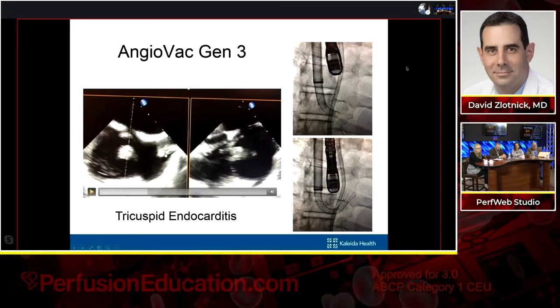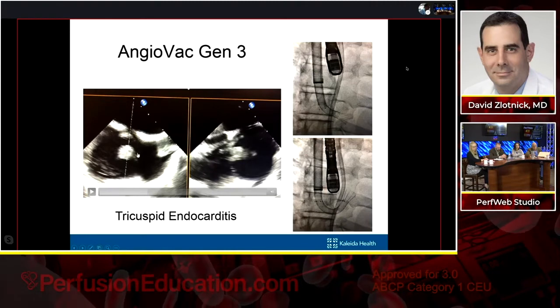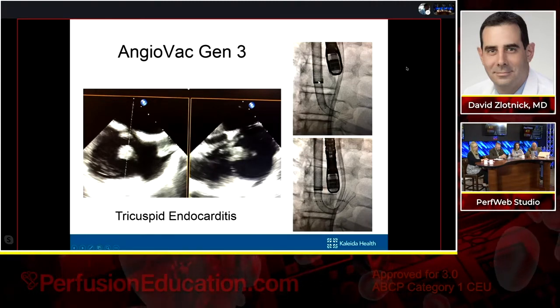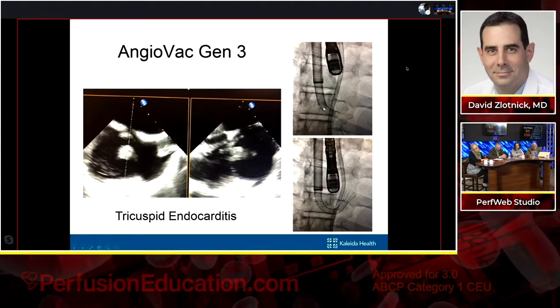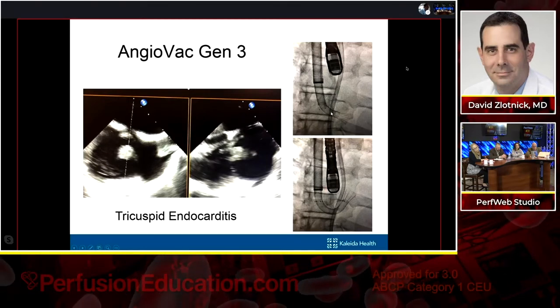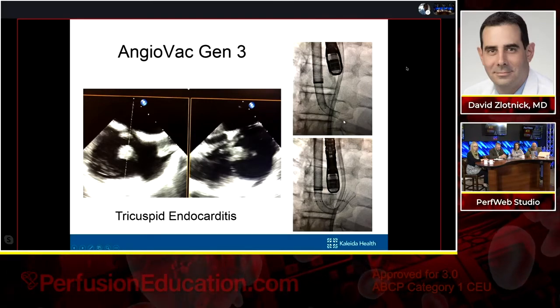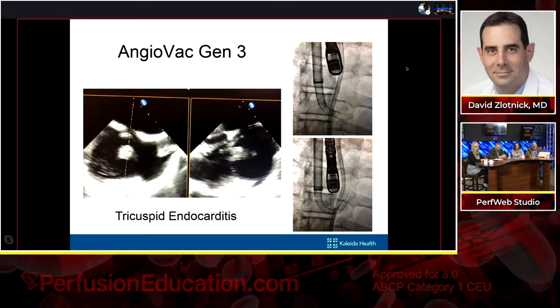And so you can see the vegetations on the tricuspid valve coming in from an IJ approach, and you can see here is the oversheath. And then here's the C180 coming out. In this instance, we're making about a 70 to 80 degree bend, which takes us right onto the anterior leaflet of the tricuspid valve. We're able to rapidly debulk this.